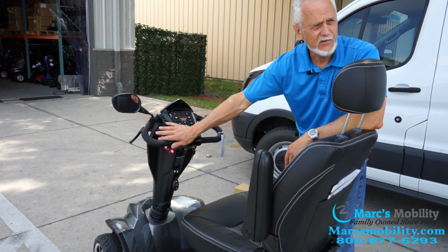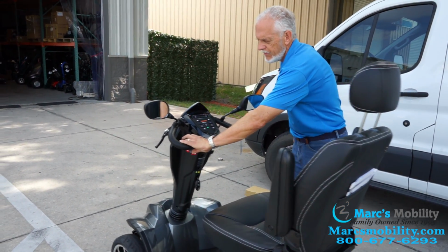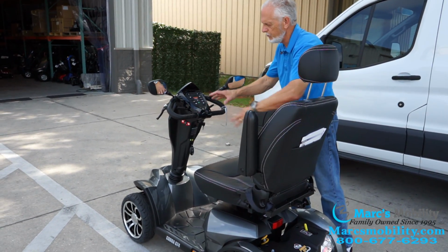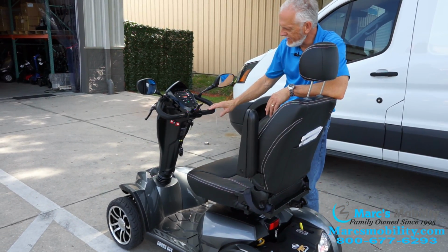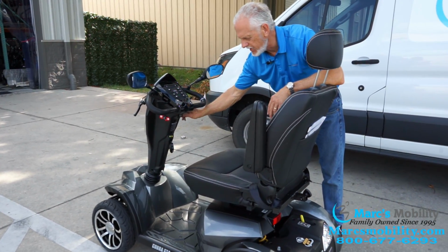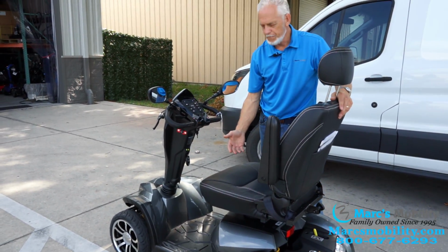The nice thing about this scooter, if you only have one hand, you can drive it this way reverse or this way forward with the same side. So you can do both forward and reverse on the same side if you had to use just one side, okay? You have your ignition key right here, right in the bottom here. This is where your key is, you come with 2 keys. They're right here. Also, I mentioned earlier, the seat does swivel.